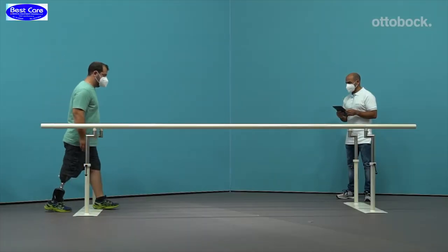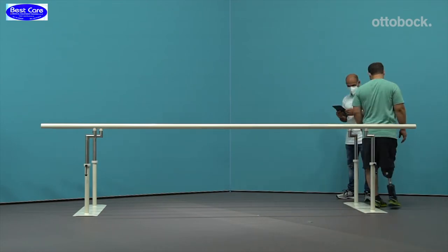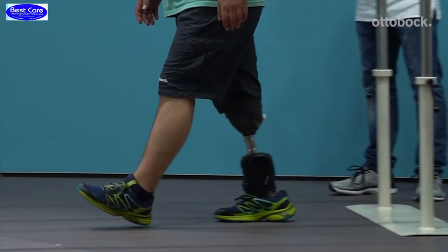Decrease the resistance if the knee is forced forward abruptly during loading of the limb or if no visible plantar flexion motion is observed.